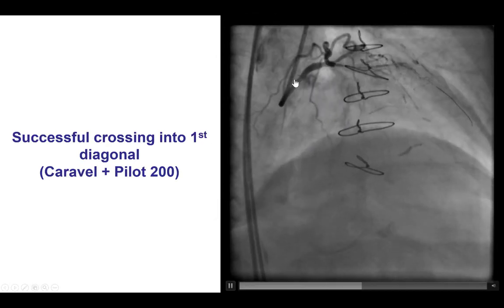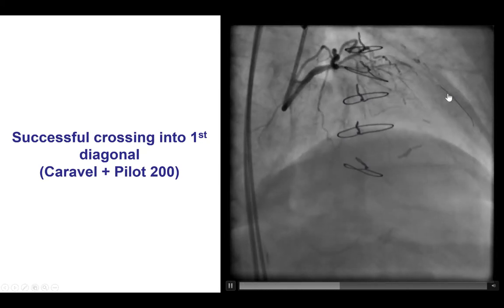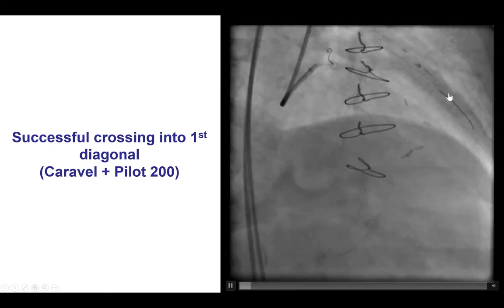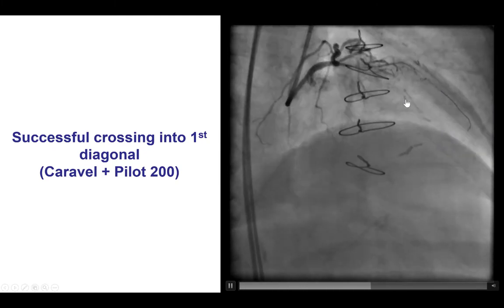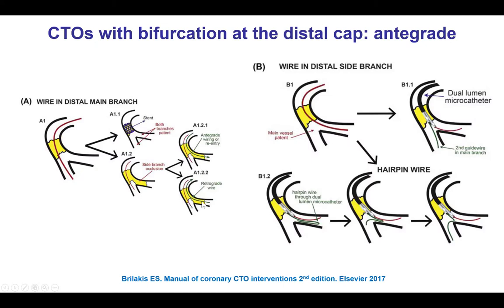We were finally able to advance a Pilot 200 guide wire into the diagonal branch. There is now some antegrade flow going into both the diagonal as well as the LAD. The question is how do we achieve wiring into the LAD, given that the antegrade wire went into the side branch. One option is to get a dual-lumen microcatheter and use the over-the-wire lumen to advance a second wire into the main branch.